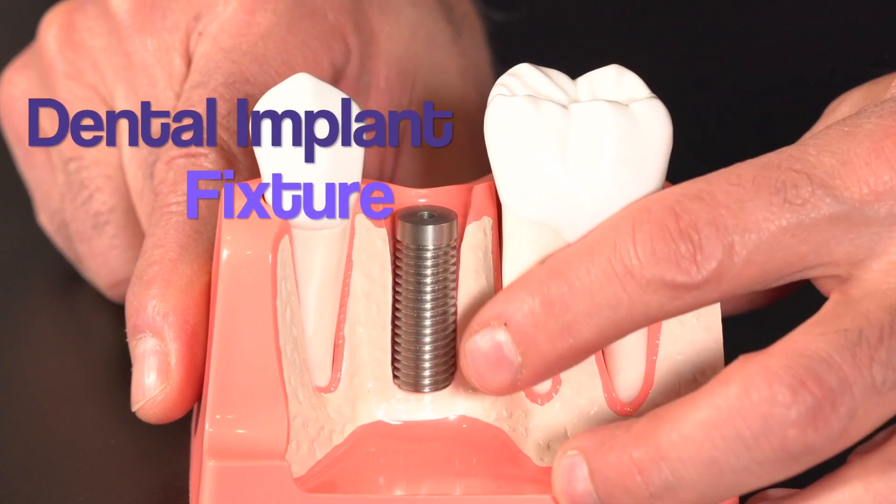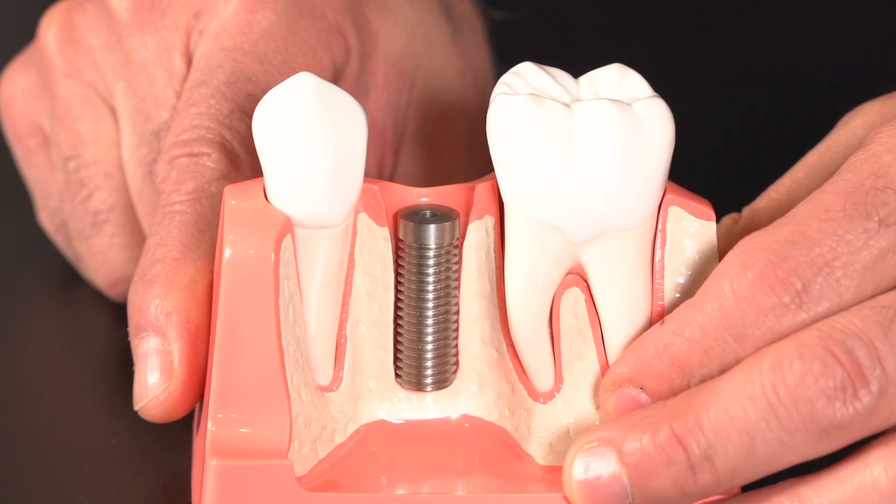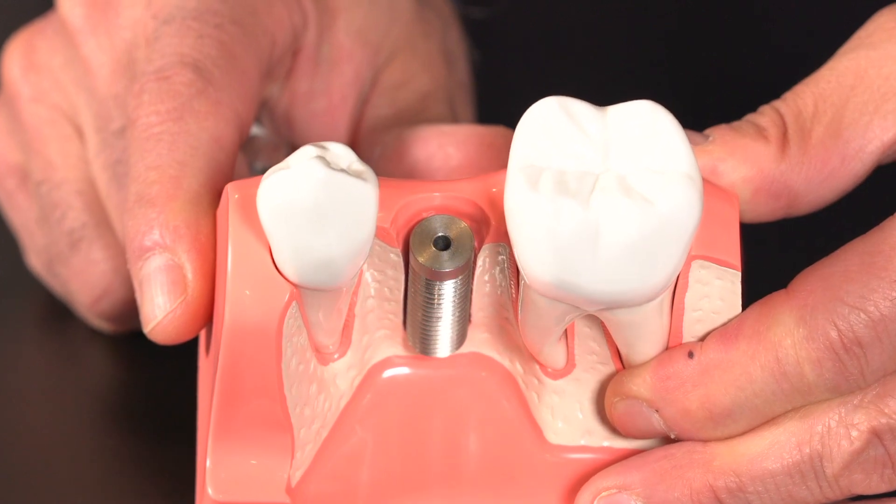The first part is the dental implant fixture, which is a very small screw-like component that is surgically placed into the jawbone. It's made of titanium or zirconia, both of which are quite biocompatible. This allows them to heal in place and fuse with the jawbone in order to create a very strong and stable foundation for the artificial tooth.